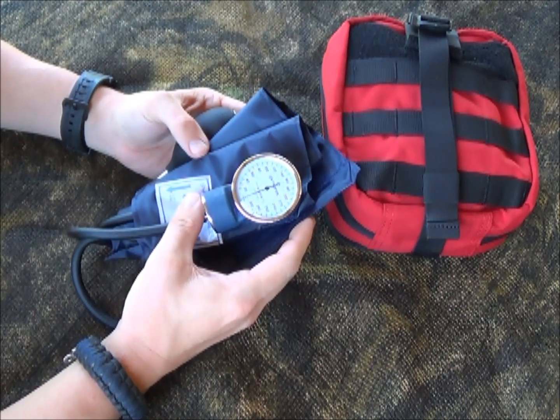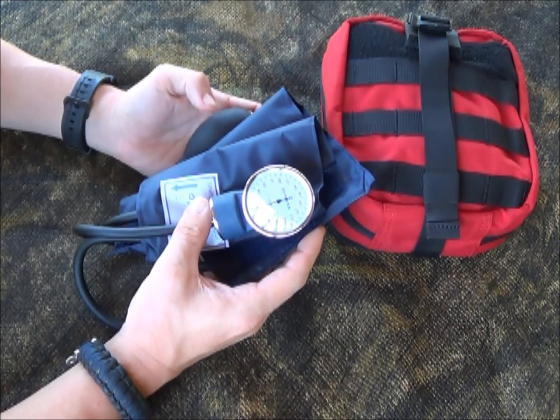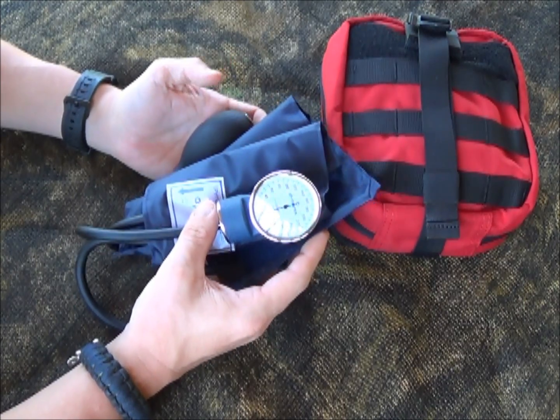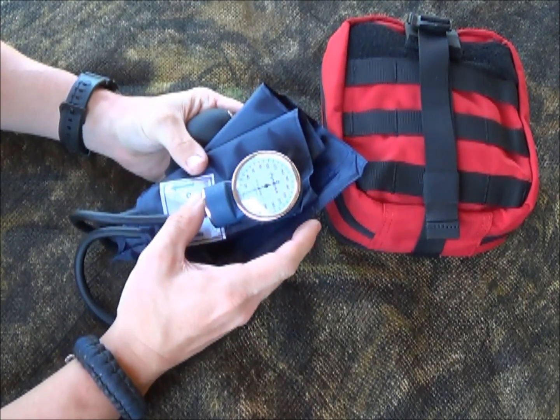Hey YouTube, welcome to another video from Skinny Medic. I want to talk to you about how to palpate a blood pressure. This is normally a little different than how you would also take a blood pressure. When you auscultate a blood pressure, you get a top and a bottom number — a systolic and diastolic number.